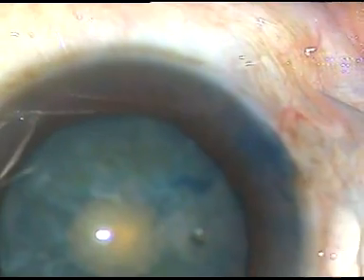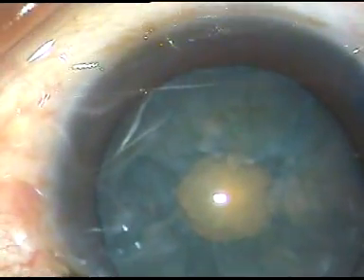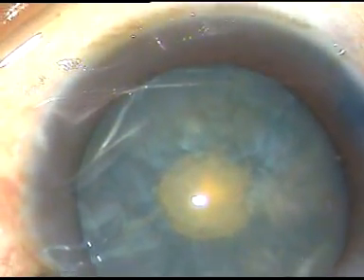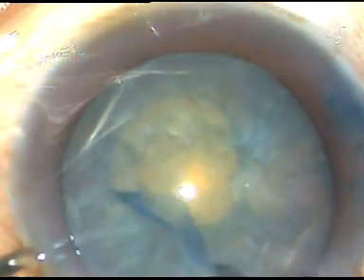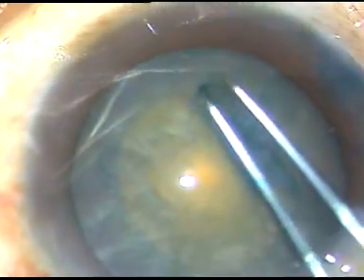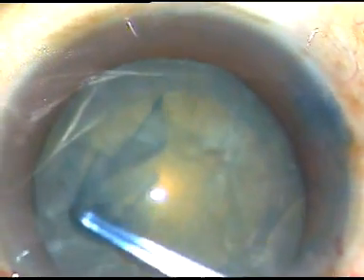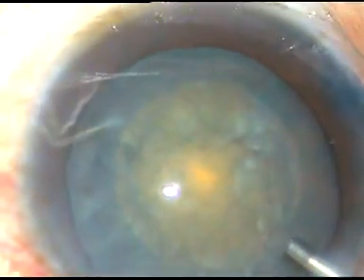Now I want to enlarge this rexis to an optimum size — viscoelastic substance is injected. I take a Vannas scissor, cut the margin of this small rexis, take a utrata forceps, hold the capsular tag, and very gently perform an optimum-sized rexis. Rexis is done — a very nice, adequate-sized continuous curvilinear capsulorhexis. The size will be about 5.5 millimeters.